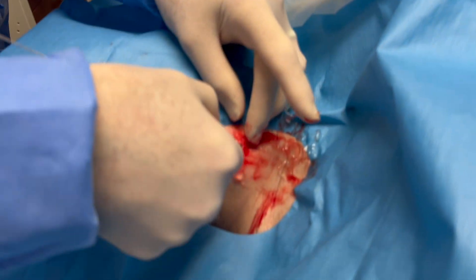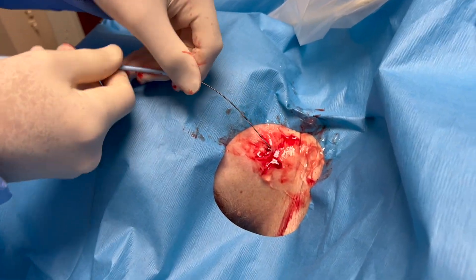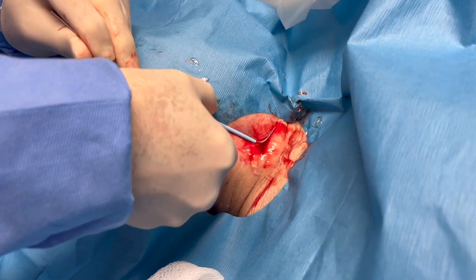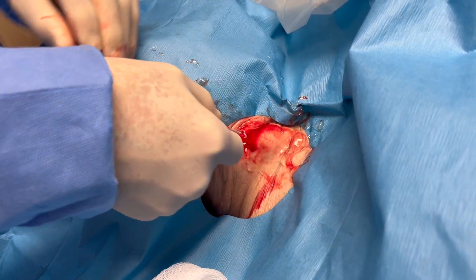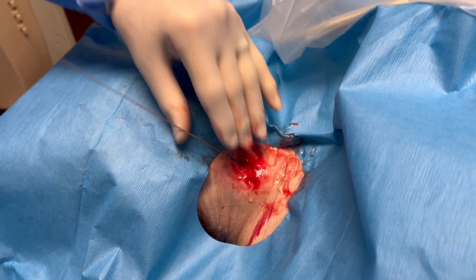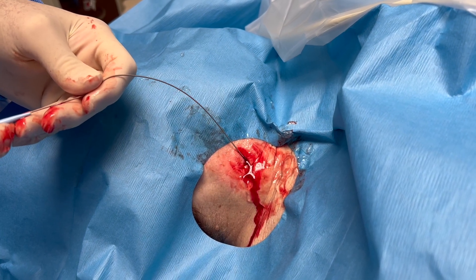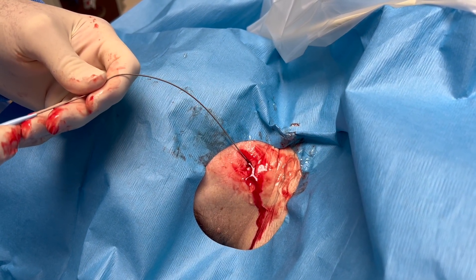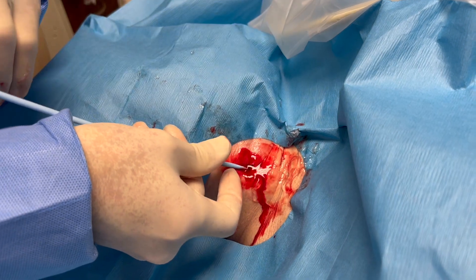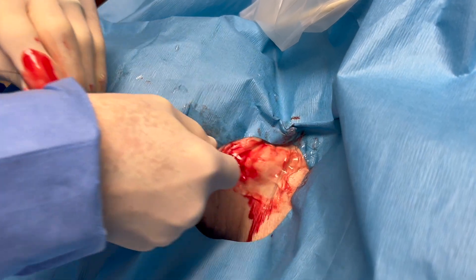This is a little bit reassuring since these catheters are rather large. You can pull either your needle or your catheter off using the same technique. Now you're going to have to put some dilators in to get the catheter in. Make sure you're able to hold the wire at the end of the dilator before you push it through — the same applies for the dialysis catheter itself. Sometimes there'll be more than one dilator needed. If you've got them nicely numbed up, it should not be all that uncomfortable. Make sure you pull the wire back far enough and grip the end before you push it through into the vein.